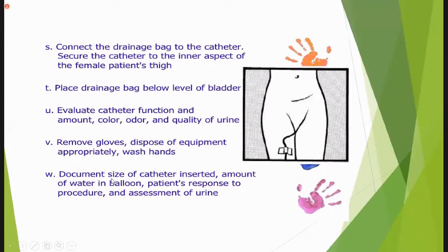And document the size of the catheter inserted, the amount of water in the balloon, the patient's response to the procedure, and the assessment of urine. All of these things, document in the file.